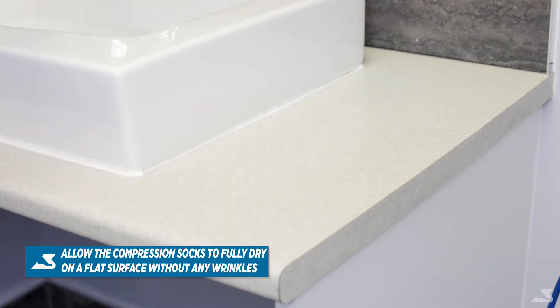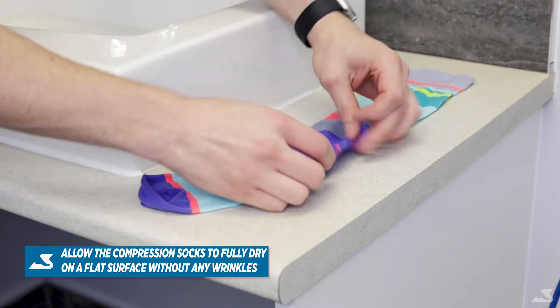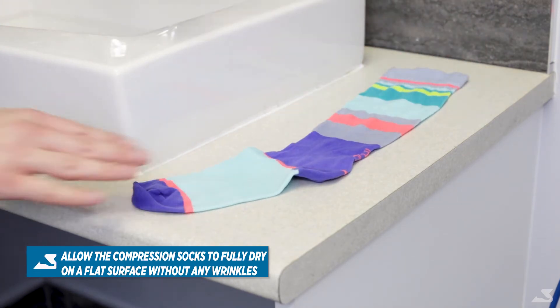After repeating this process on the other sock, you'll want to place the compression garments onto a flat surface, such as a countertop or a drying rack.